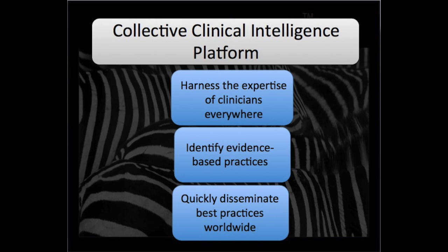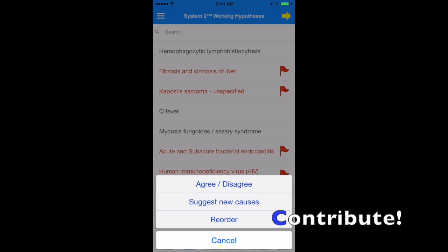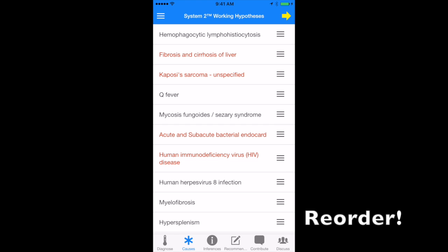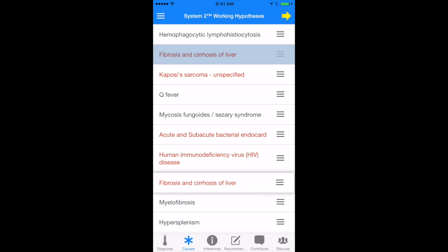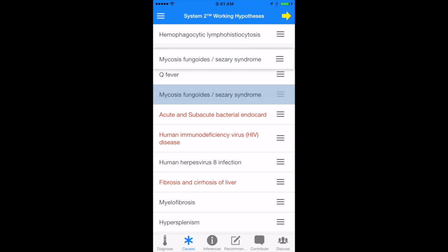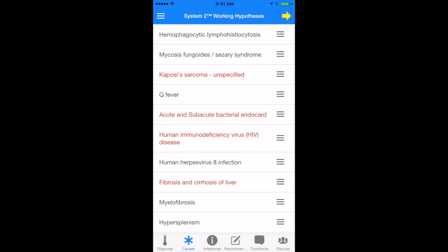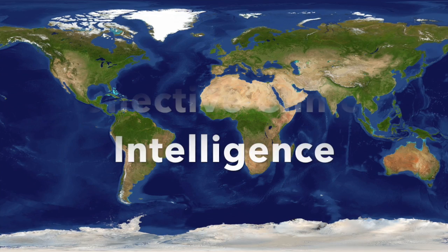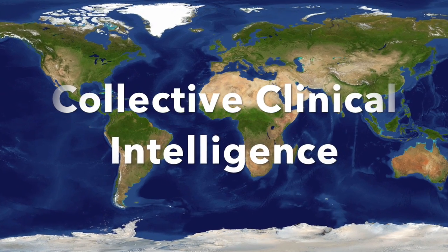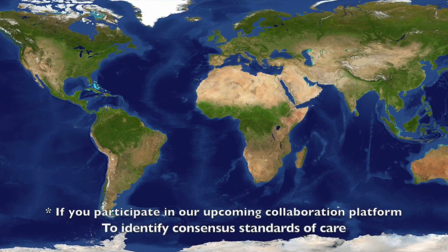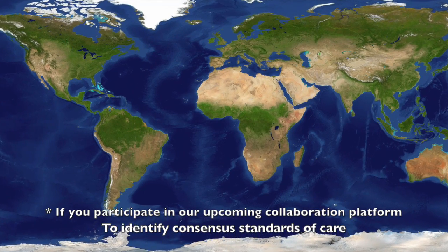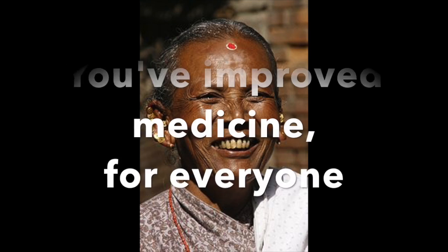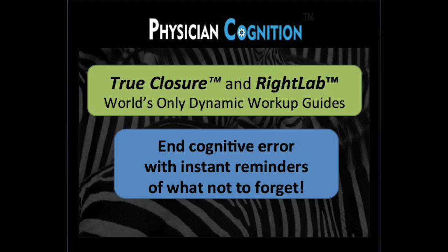We were hoping you would ask that. Are any differentials out of order? Well, tap contribute in the lower right. Tap reorder and you can drag them to your heart's content and we'll record your opinion. Tap contribute and submit your new order. Our advisory board will review your suggestion and clinicians from all over the world will vote on it. And that's something to feel good about.